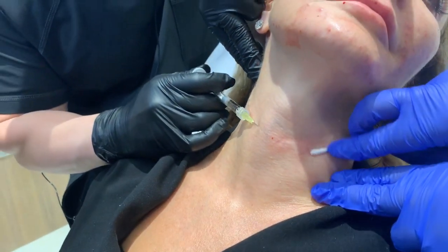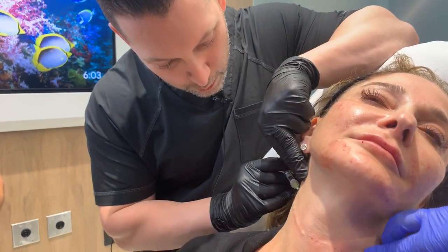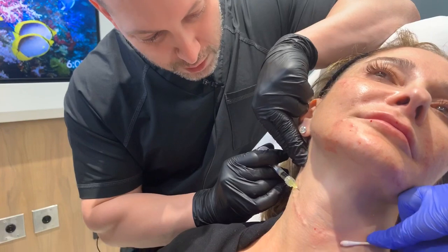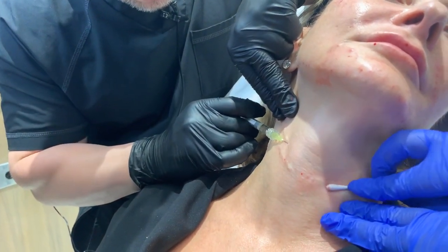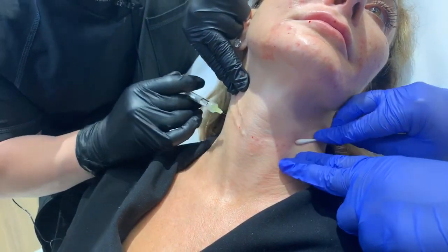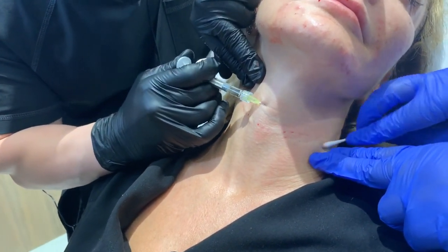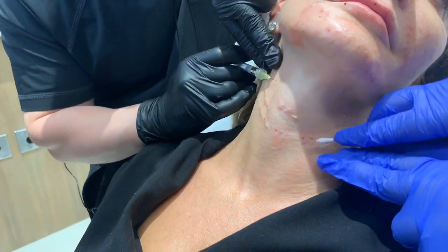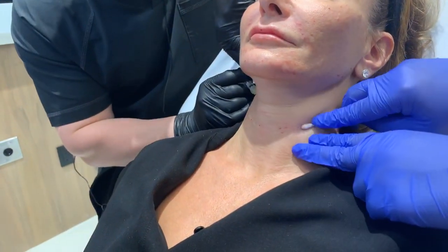And can you use any type of filler for tech neck? No, this is a superficial filler. I personally like using this. I know other doctors use thicker fillers here. I think there's a tendency to clump and lump. I think long term the nicest thing is to do soft, fine wrinkle improvement, and that's using Belotero, which is one of the more superficial fillers. Should bring your neck down a little bit. There you go. Follow some of these folds.